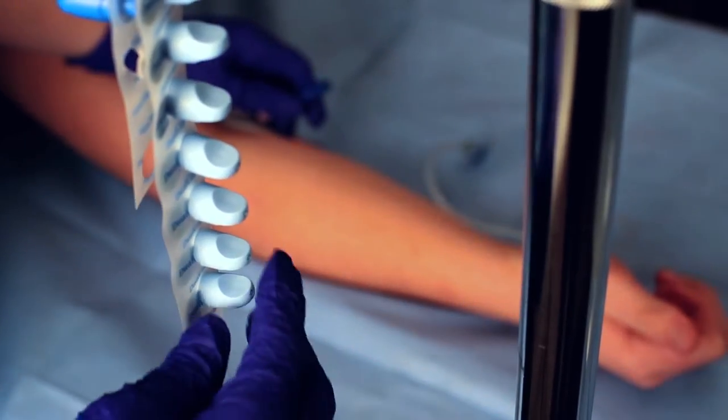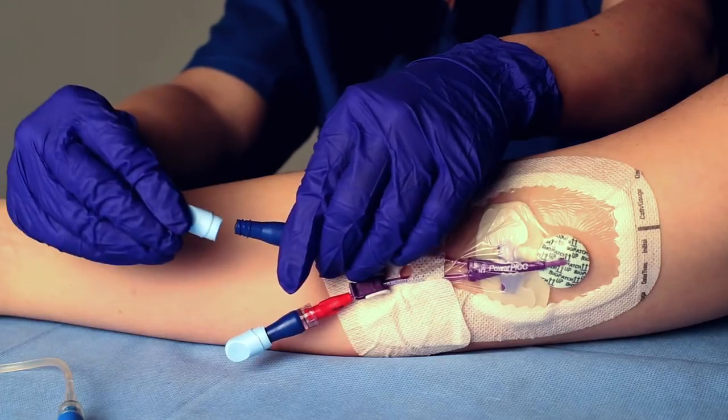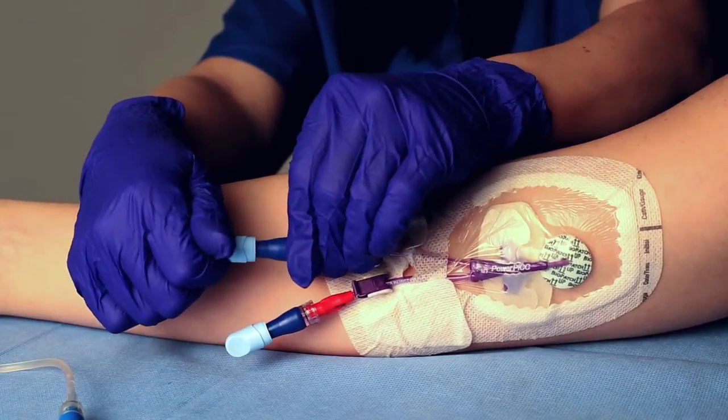Grasp the light blue dual cap and remove from IV pole strip. Attach cap to Luer access valve by twisting until secured.